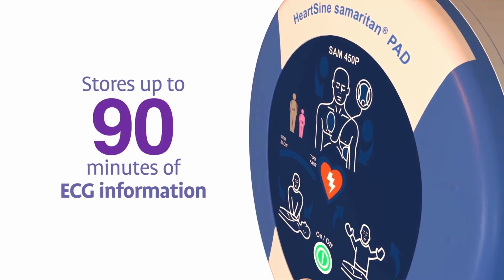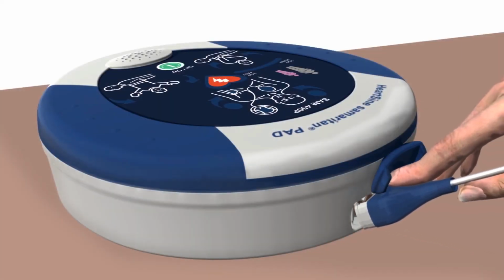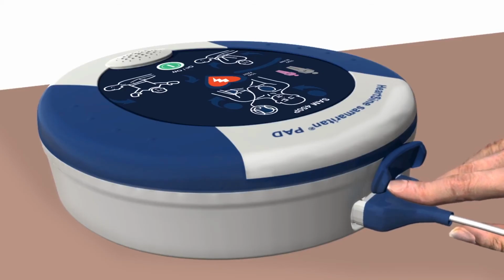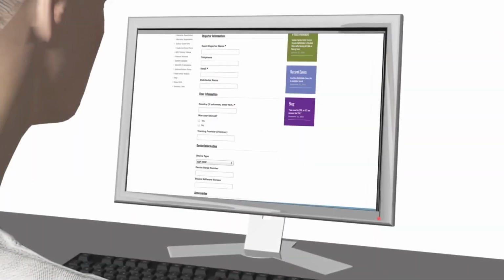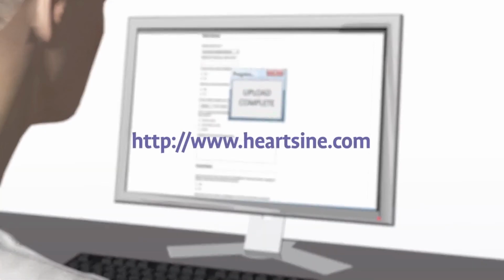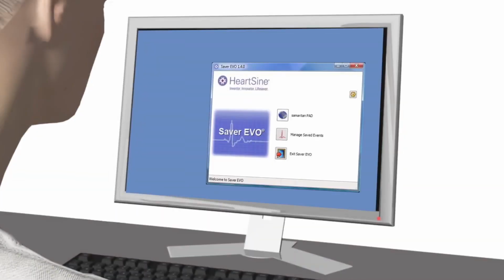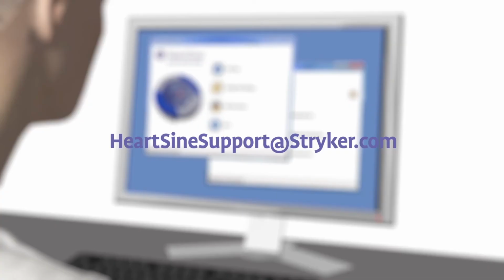The Samaritan PAD stores up to 90 minutes of ECG information after use. Use the Saver Evo software, which can be downloaded from the HeartSine website, and the custom USB data cable to download the event data for a physician who may want the information from the device to formulate treatment decisions. After using the Samaritan PAD during a sudden cardiac arrest, submit to HeartSine the Saver Evo file and a completed customer event form. HeartSine will send you a free replacement pad pack. After downloading the event data, please erase the data from memory. If you need assistance to do this, contact HeartSine Technical Service.